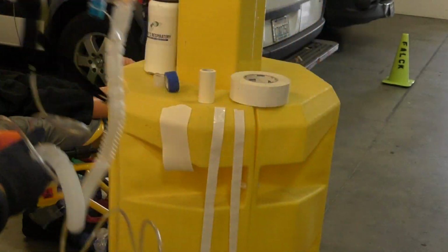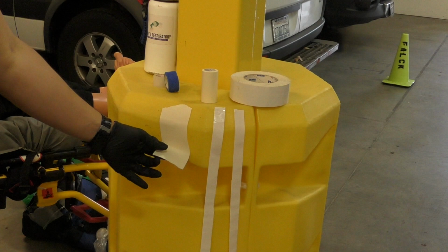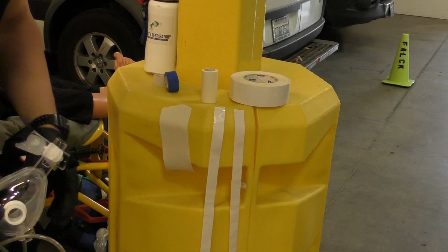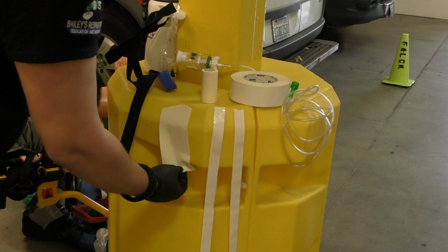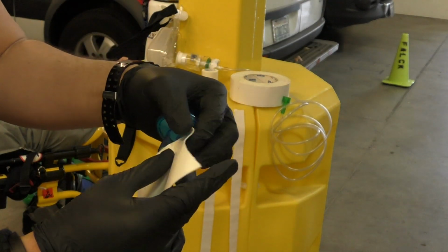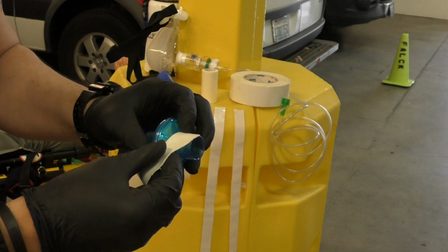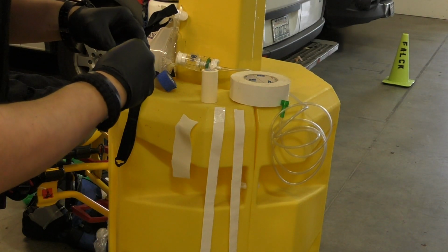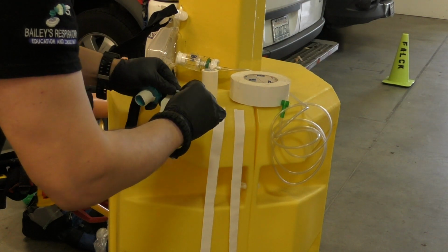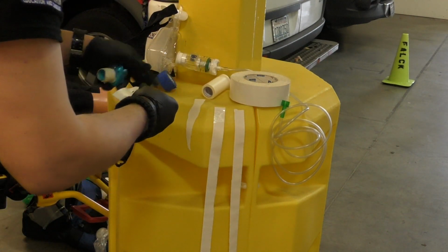This has this orange part on it, okay? We also have this foam tape, which works great. You notice that I took out about a dollar length size of the foam tape. What I'm going to do with that is hand rip it into strips that'll fit on the filter. So I'm going to do a thin strip. You don't have to cut it or anything. There's one. We're going to cut this into three strips and use all three strips, okay? It's not the easiest thing to rip.